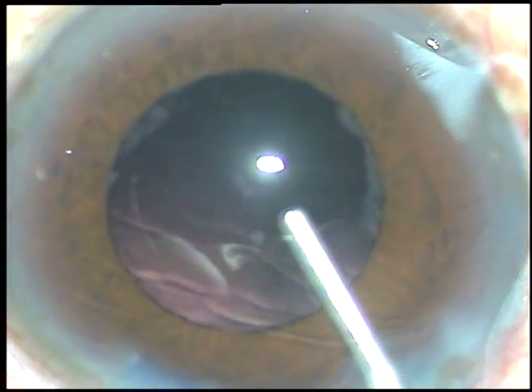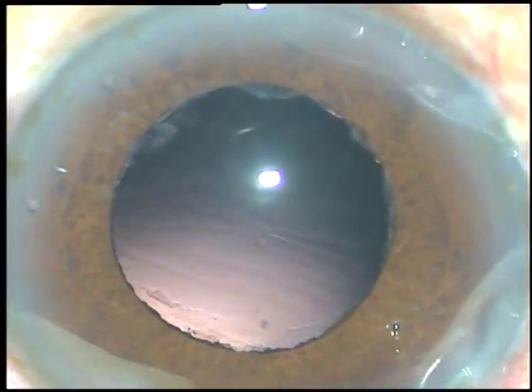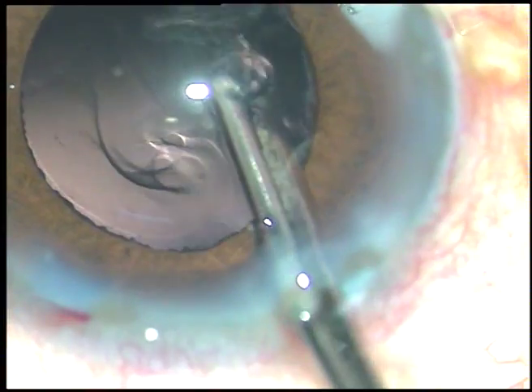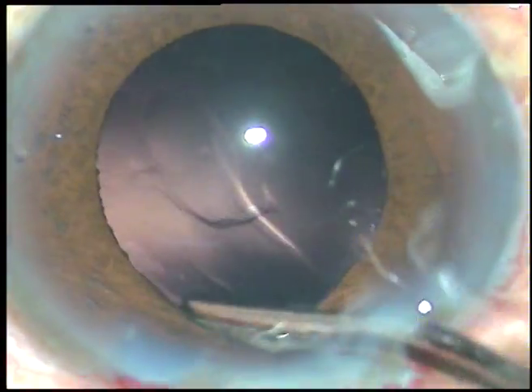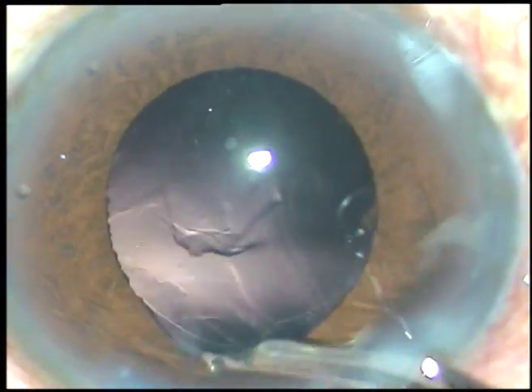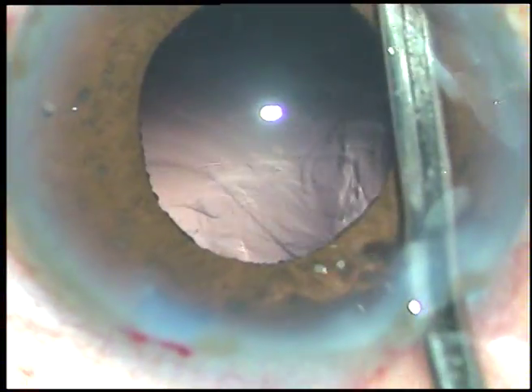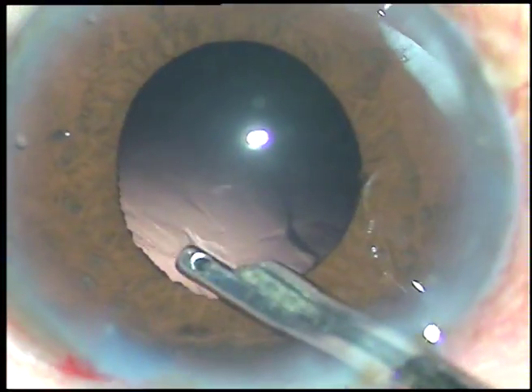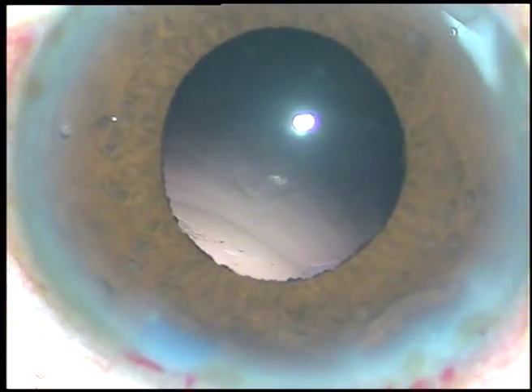Some amount of viscoelastic substance is injected. Now, some cortical matter is there which is hidden by the iris — you must remove it. Catch hold of this cortical matter and remove it. I retract the iris with the Simcoe itself and find that there is no remaining cortex. So, the cortex has been removed nicely.